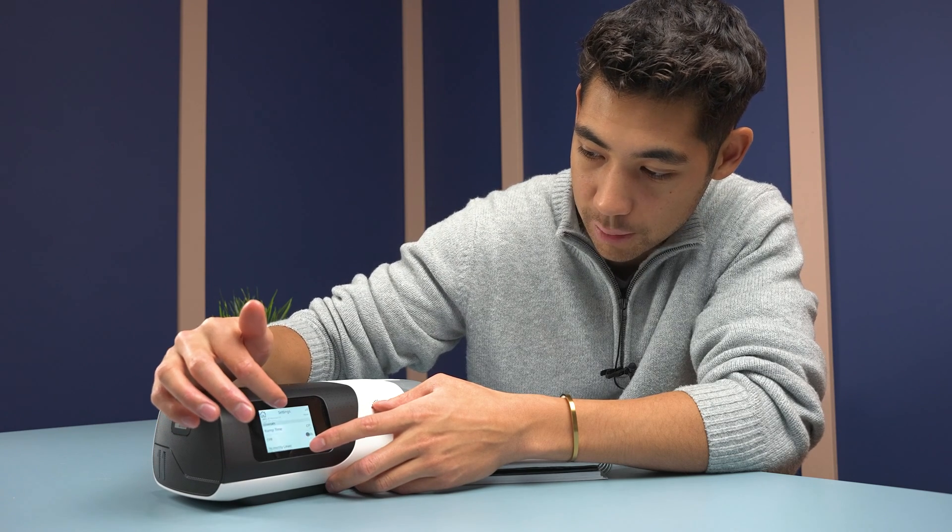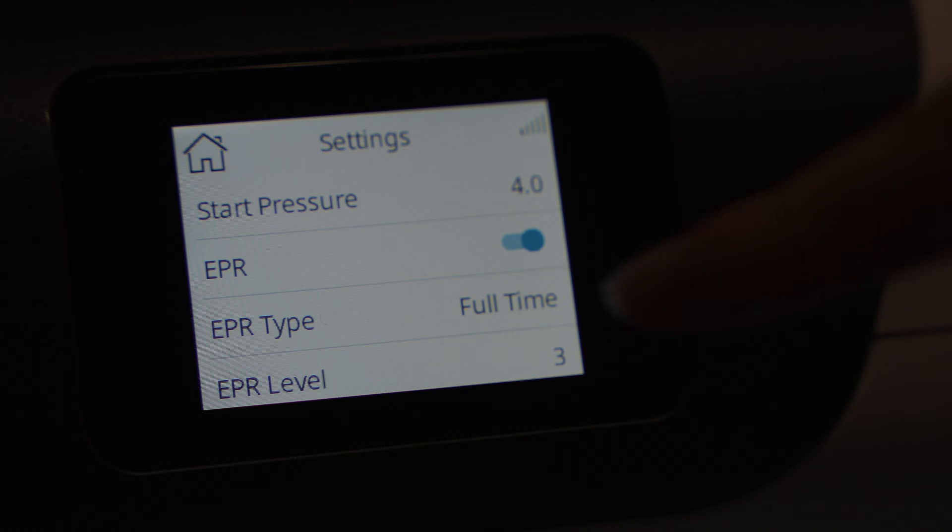You're also going to see things like ramp time and set pressure. Your EPR — you want to turn that on.